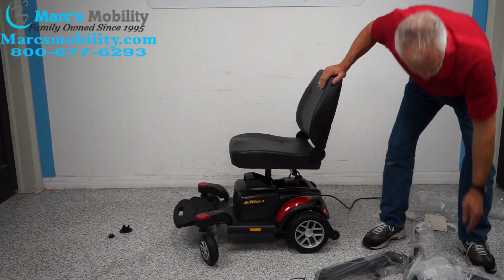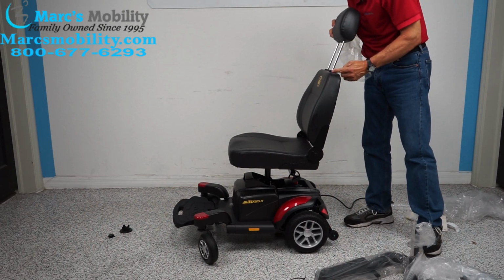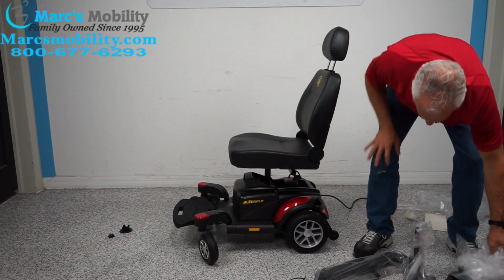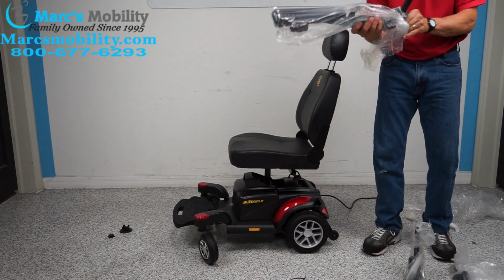The next thing we're going to do, you're going to take the headrest and you're going to push the little button here. Let the headrest go in the slot. We're going to take the arms, okay, get them out of the bag.